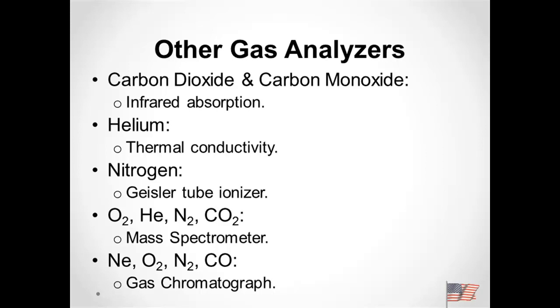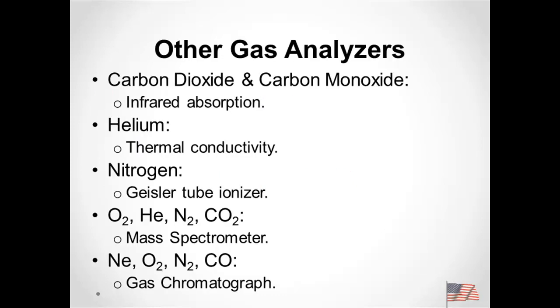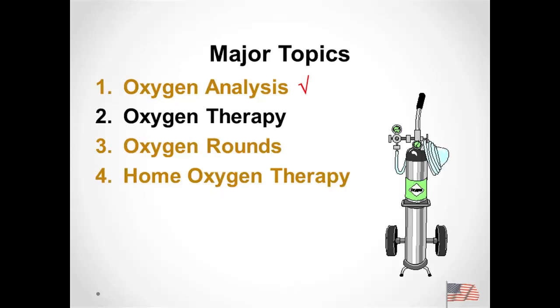So they know how much oxygen is there versus nitrogen by seeing the mass of each of the constituent components. Cool technology. Same as gas chromatography. Again, recognize there's other ways to measure gases. That's the big part I wanted to say. Don't worry about it. Okay. Just recognize that there's other ways.